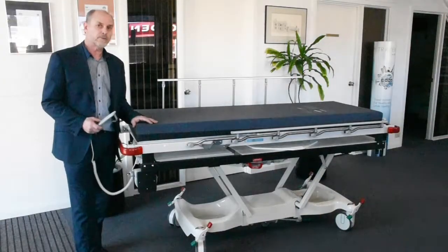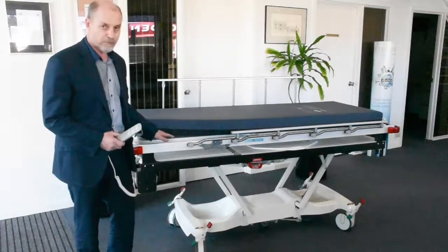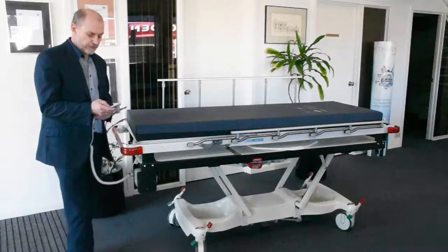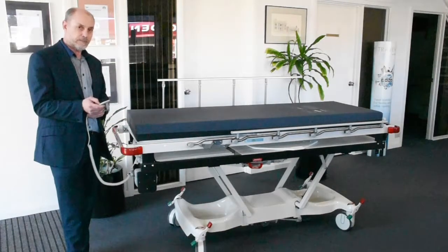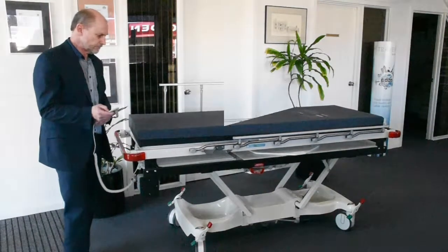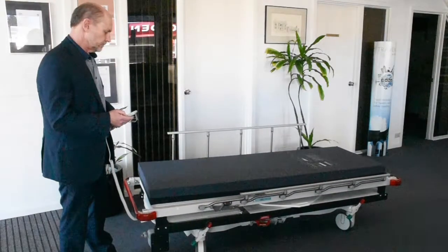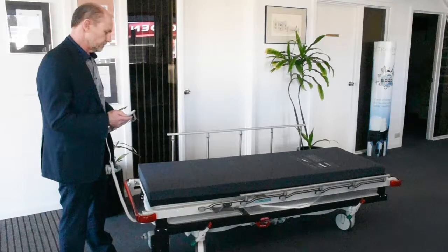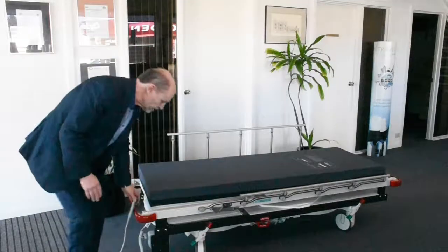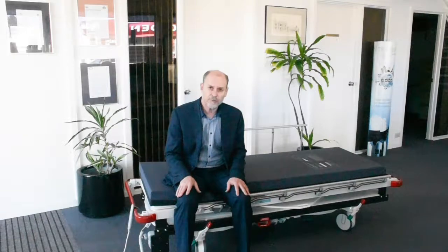The maximum height of the Contour Porter X is 87 centimetres, measured from the floor to the top of the frame — not to the top of the mattress. The lowest height is 42 centimetres, which is very useful for emergency patients, especially those that are short of breath.